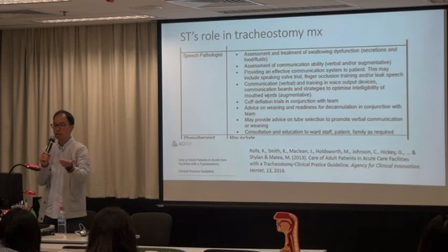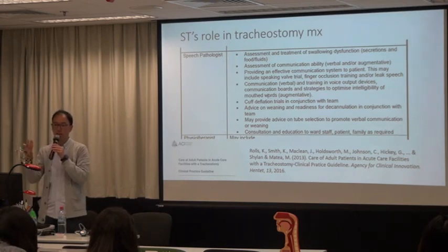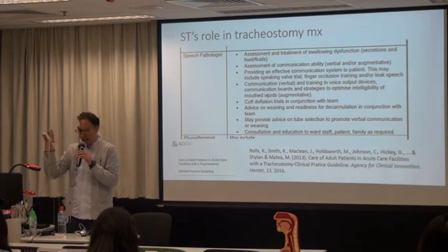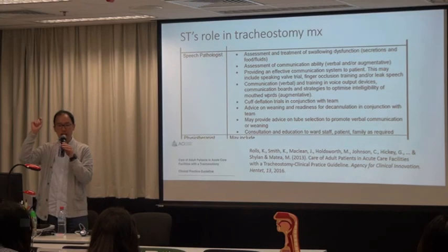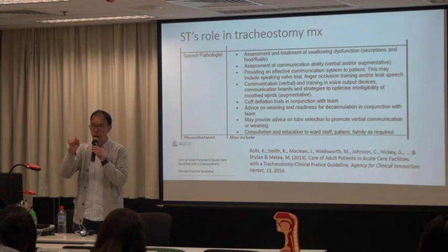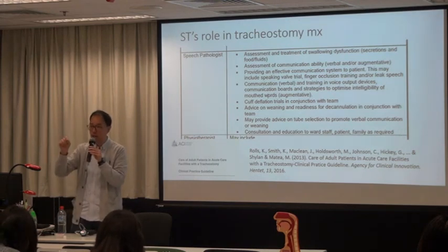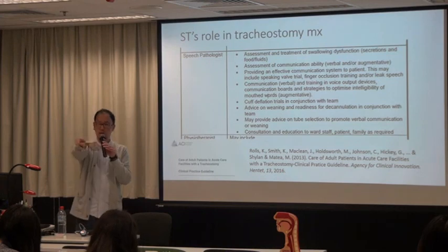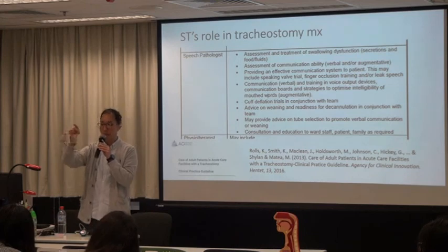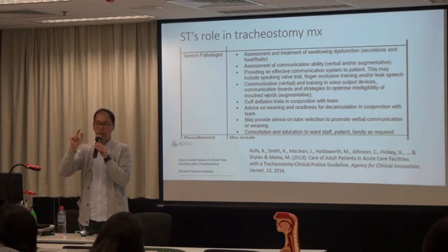So it's imperative that you understand all these as well, because without sufficient knowledge, you're going to be embarrassed. I've had a colleague, well, I shouldn't say that because it's a Queen Mary colleague, but I've had a colleague who demands that the patient's family go and get a fenestrated inner tube. Okay, the one who is holding the shiny, yeah, there. The patient has a shiny tracheostomy tube, but actually has a non-fenestrated outer tube.